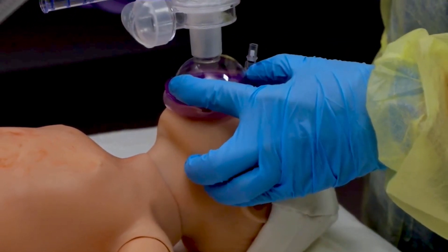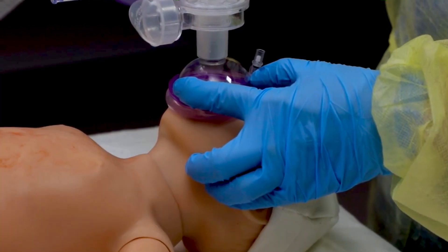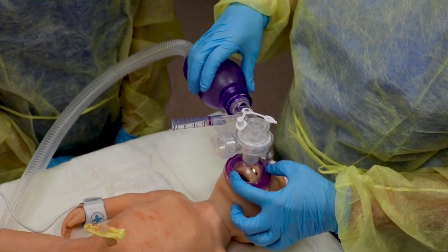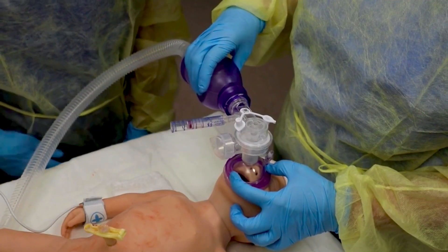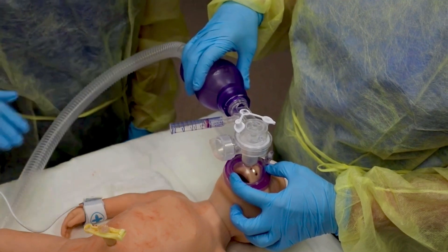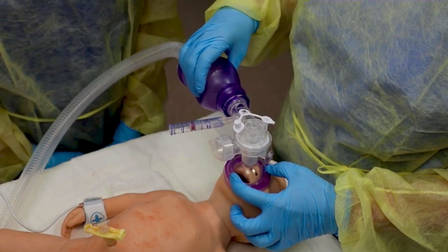Now you're ready to assess the effectiveness of your PPV. People often get nervous and ventilate too fast, so help each other maintain the correct rate. Breaths are given at a rate of 40 to 60 breaths per minute. Use a waltzing rhythm.